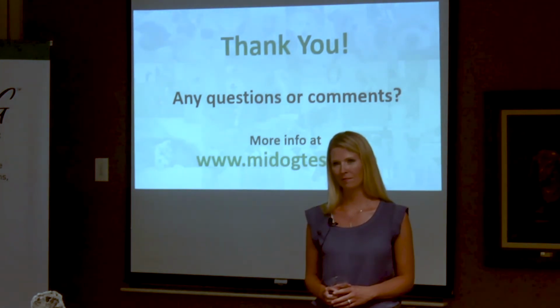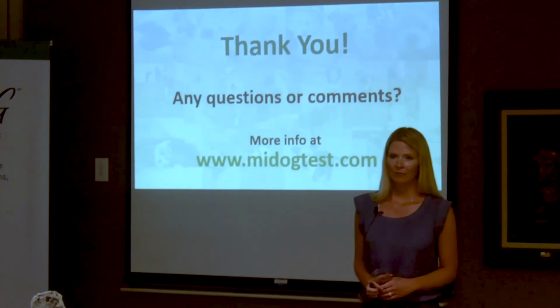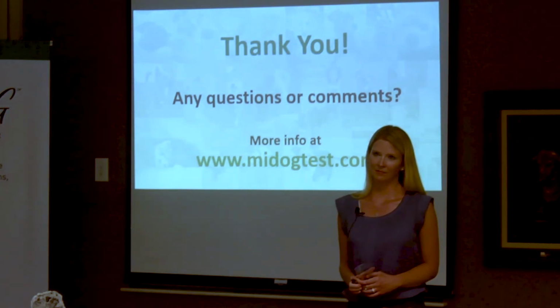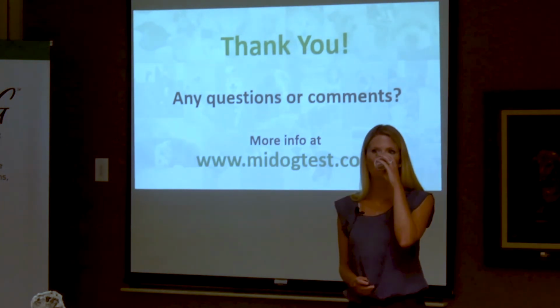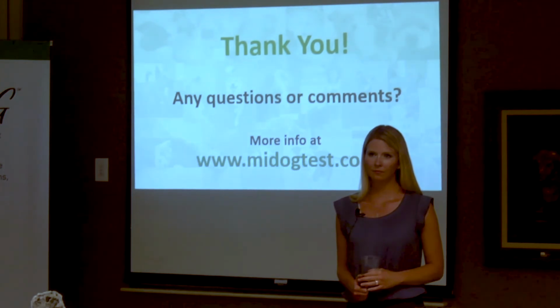The other thing is we also recently found out, and she also mentioned it in the presentation videos, that a lot of results from culture tests come from only 1 or 2 or maybe 3 single colonies, using that to represent the whole sample, because culture just cannot go deep. Those cultures are expensive, so based on how much they charge, they only test a few colonies and use that to represent the whole thing.